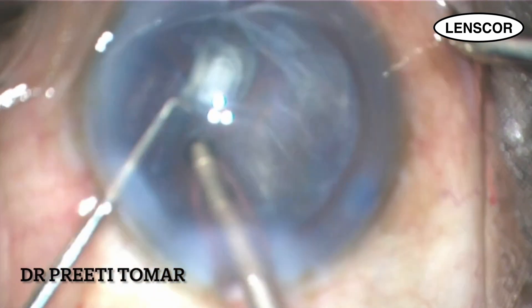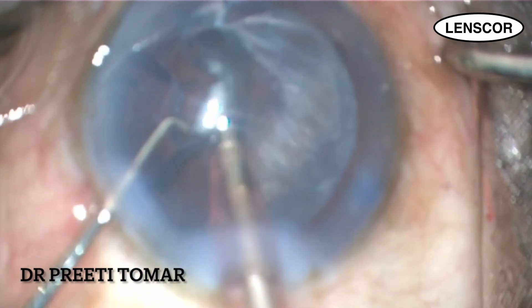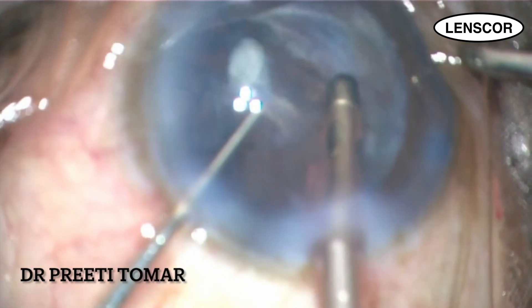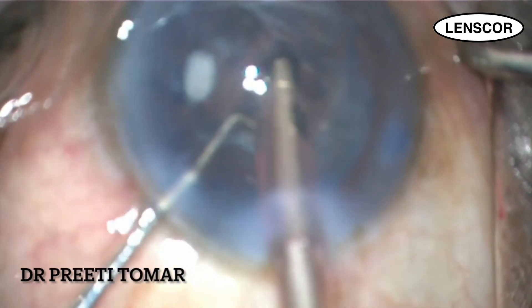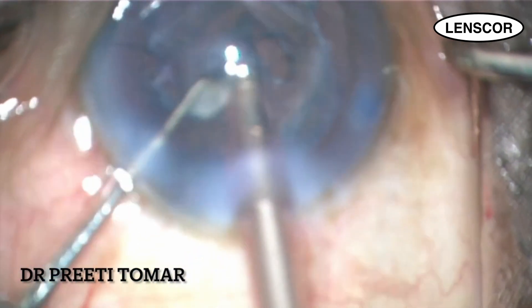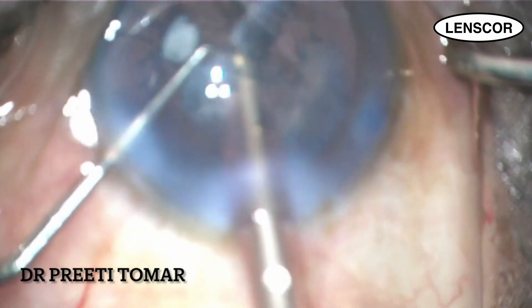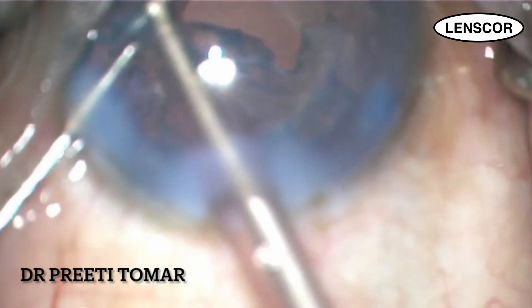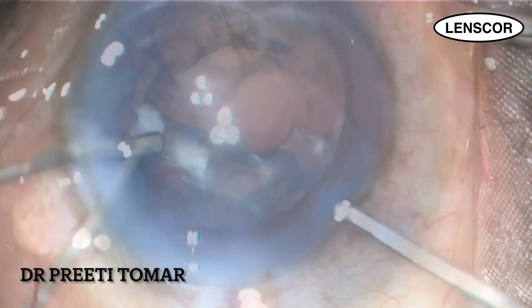Irrigation and aspiration is a critical step and we have to be vigilant during the process. As I continue to aspirate the remaining cortical matter, I see the defect opening up and a large posterior capsular tear is staring at me. I inject some viscodispersive from the second port to provide tamponade on the tear, and I come out of the bag.